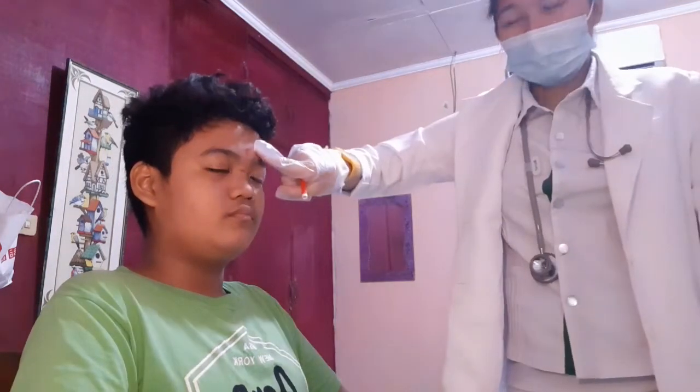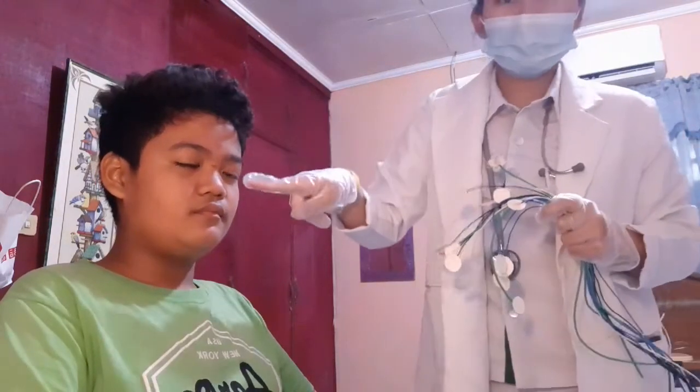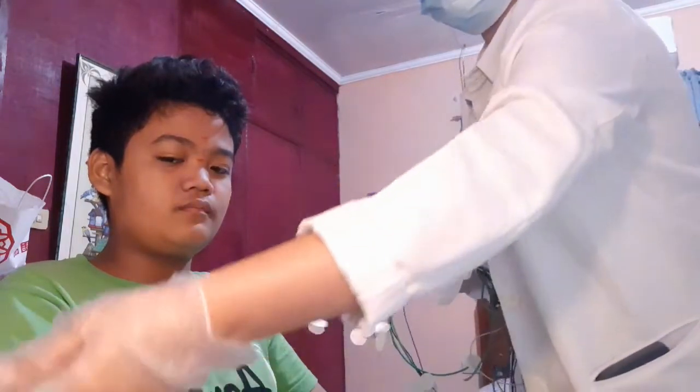Fp1, and this is our Fp2. As you can see, there's a landmark here, so no need to measure it again. I have here the electrodes, the 10-20 paste, and the gauze. We will be using them later, and the pulse oximeter. Okay, so let's start.